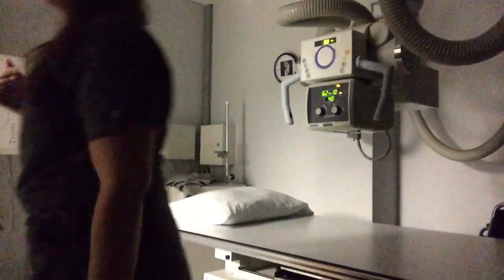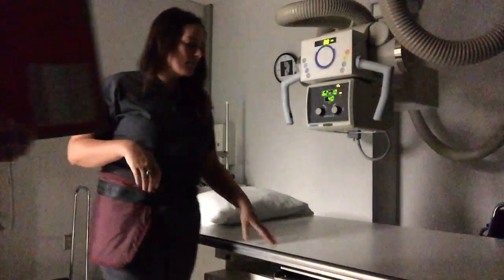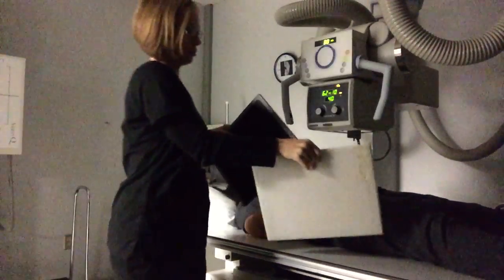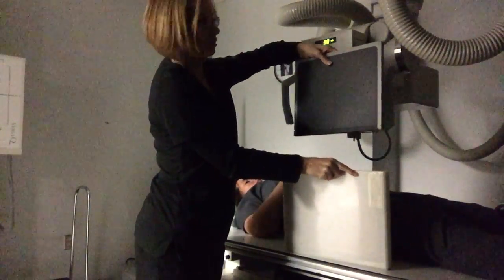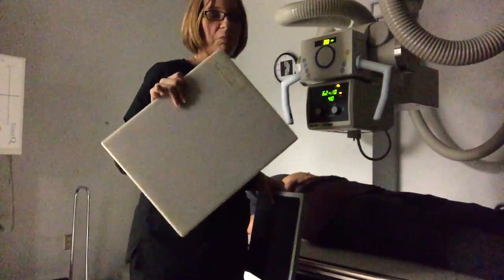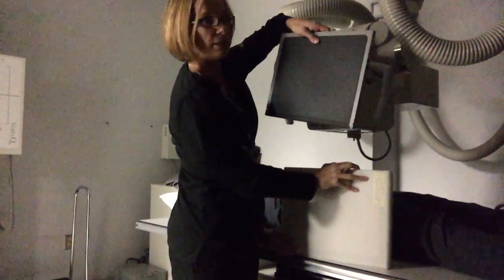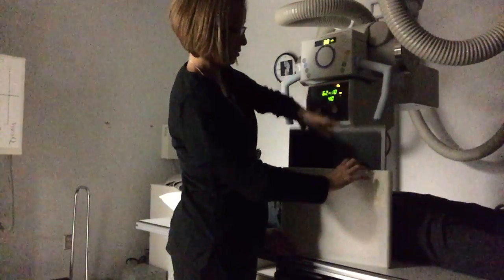For this one, the patient is going to lay on the table with her head on the pillow. We're going to use a grid — we have a 10 by 12 grid, and there should be one for each room. Slide the IR into the grid. When doing a tabletop exam, image quality is going to be better if you use a grid. You want the black side against the grid so the orange side is sticking out.